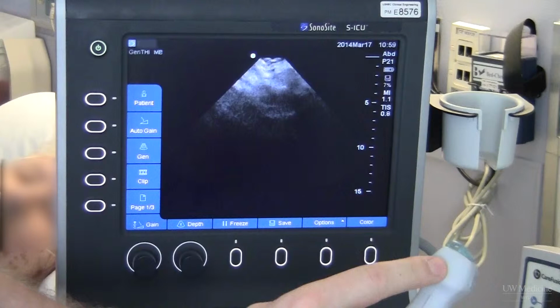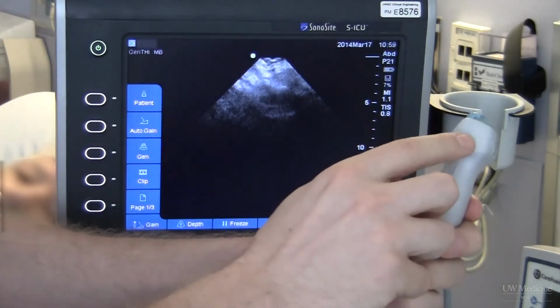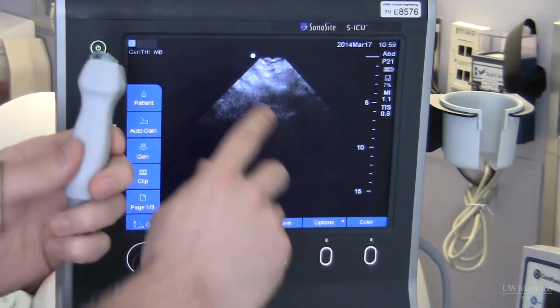The phased array probe has a square footprint. As opposed to the rectangular image created by the linear probe, the phased array probe creates a cone-shaped image as shown. With either type, the dot on the transducer should point to the patient's right side. This corresponds to the dot on the left of the ultrasound screen.